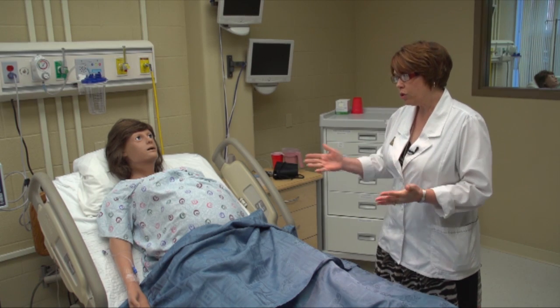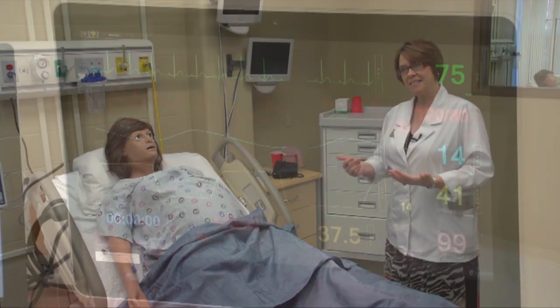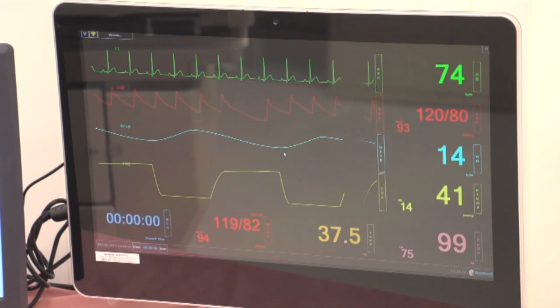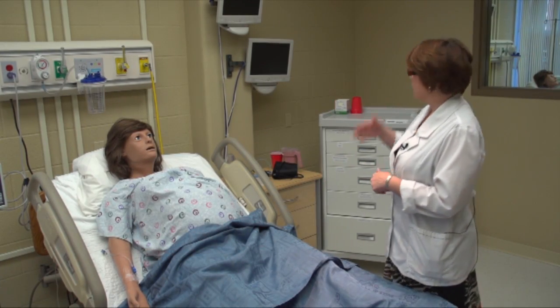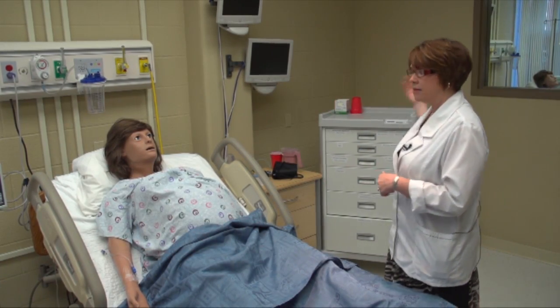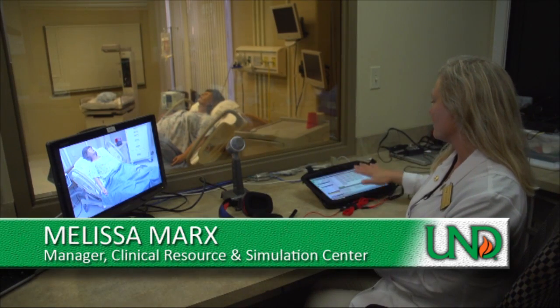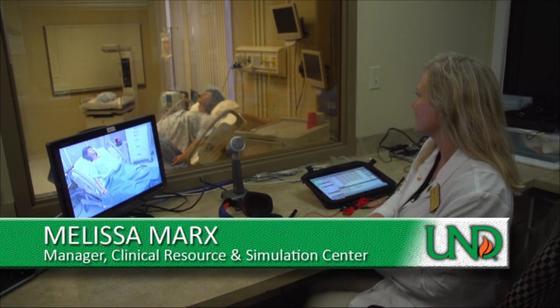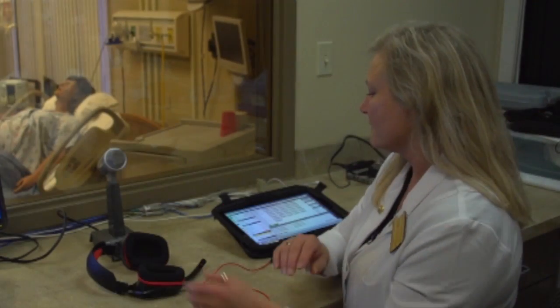We can control her vital signs such as blood pressure, pulse, and even the amount that she bleeds with a computer system behind the control room wall. We are the control panel for any of the simulators that are in the room being used.